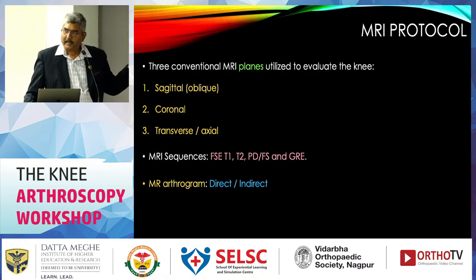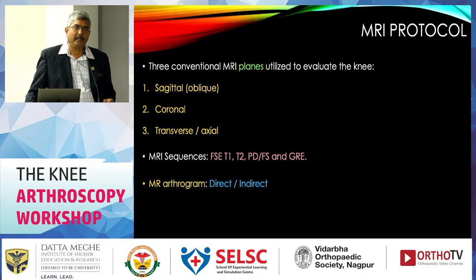We sometimes take fat suppress. PD fat suppress is a routine thing, but if at all we are going ahead with contrast, we will take T1 fat suppress sequences post contrast.